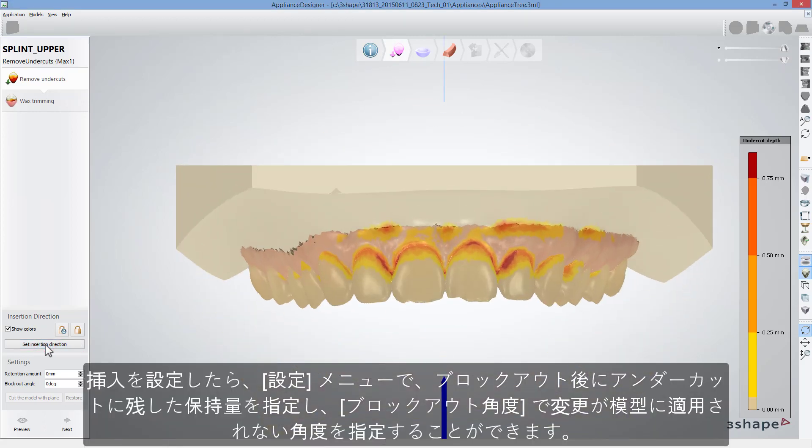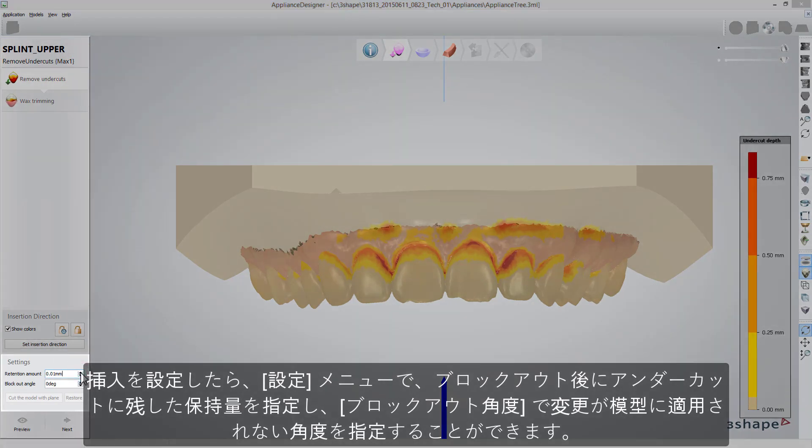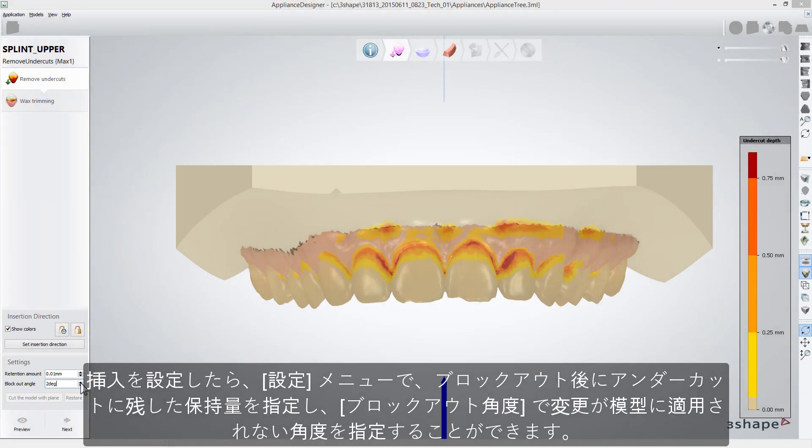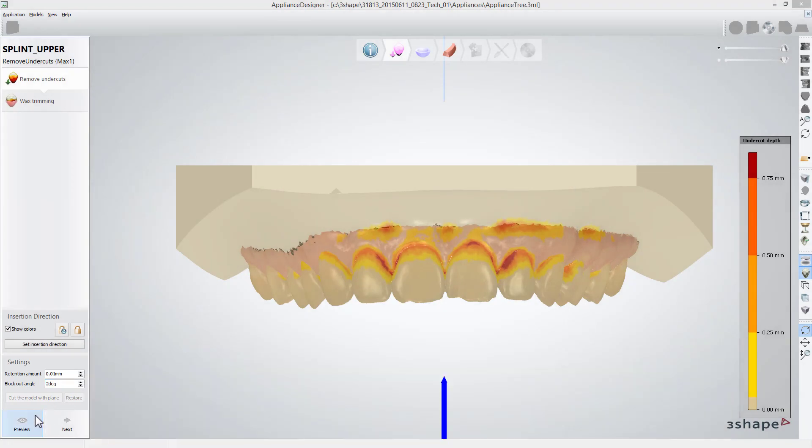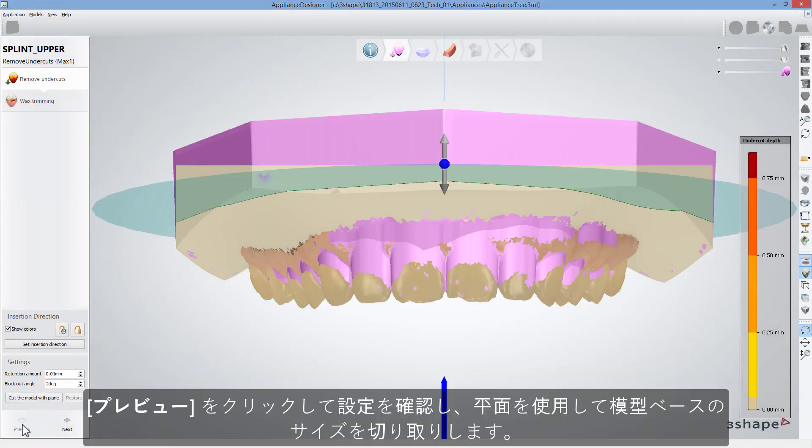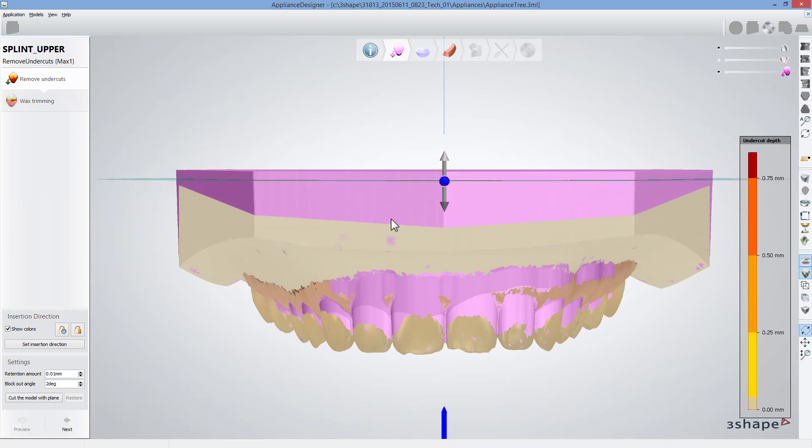Having Insertion set, in the Settings menu, you can specify the amount of retention that will be left in undercuts after blocking out. And you can set the angulation for the blocking out material in the Block Out Angle box. Click Preview to see your settings applied. And use the Plane to cut the size of the model base.